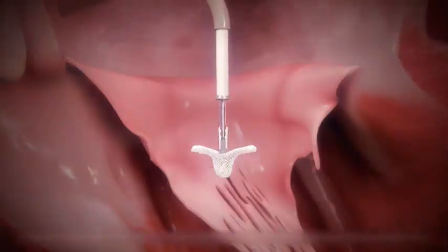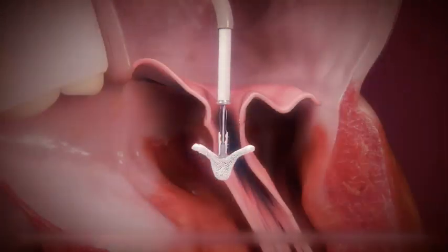The clip is advanced into the left ventricle below the valve leaflets and retracted to grasp the leaflets.